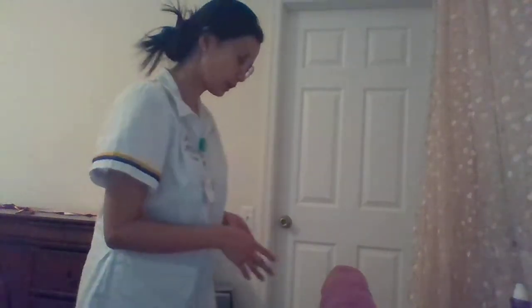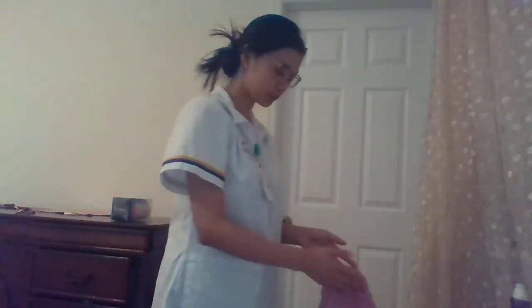I'm going to knock on the door, enter the room, and wash my hands. Hello, my name is Ying, and I'll be your student nurse today. Today I am going to give you an intramuscular influenza vaccination. Before we start, can I have your name and date of birth, please? I'm going to check if the patient's words match the patient's armband, and it matches.